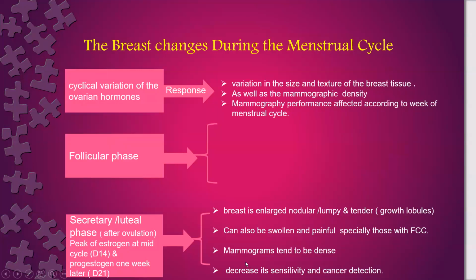And subsequently the mammogram will tend to be dense and will definitely decrease the sensitivity and cancer detection. So this is definitely not the optimum time. The 2nd, 3rd, and 4th weeks are not the optimum time to do the mammography.